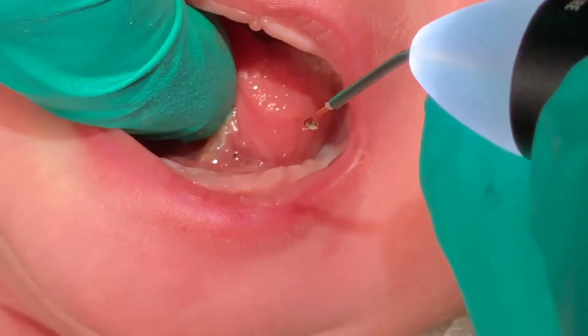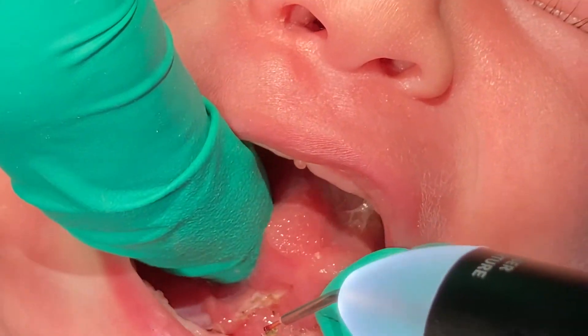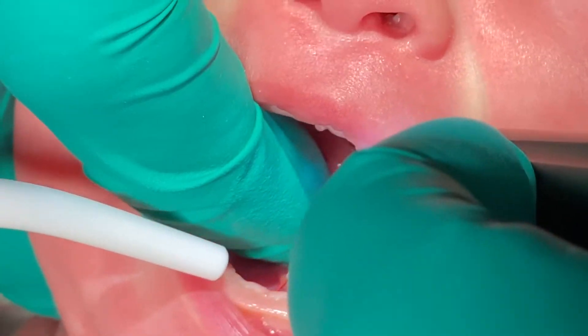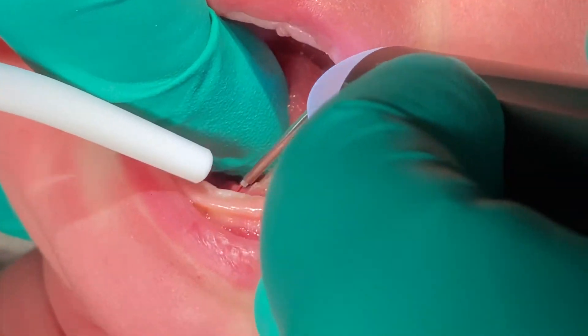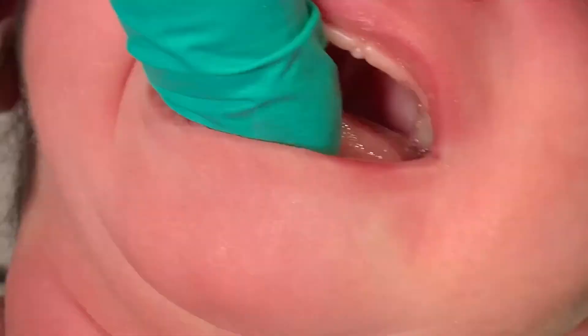You can see that the lower looks pretty well dissected and she's good.